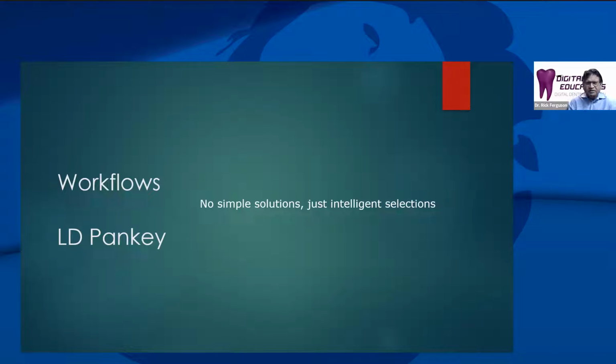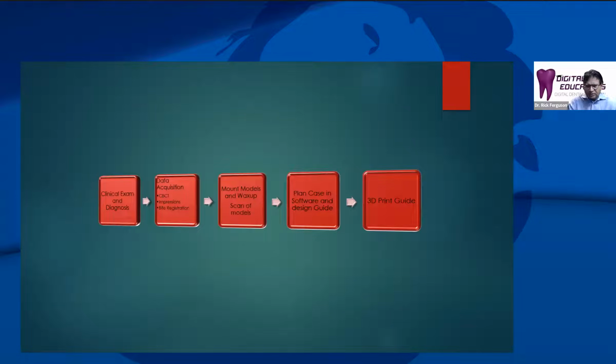LD Pankey, talking about workflows, said there are no simple solutions, just intelligent selection. So there's a certain level of complexity that's going to happen as we start to bring in these different data capture modalities. We have to figure out how we're going to incorporate these in the workflow so that we can get into the digital design software and then output from that a product that we can fabricate.